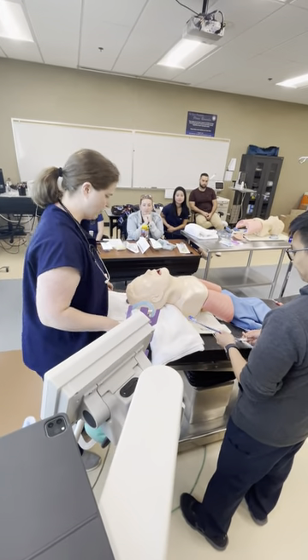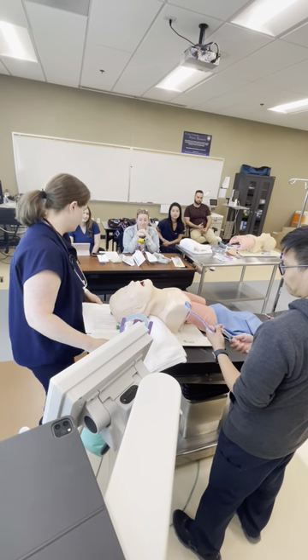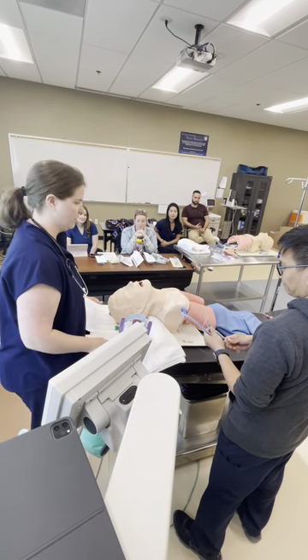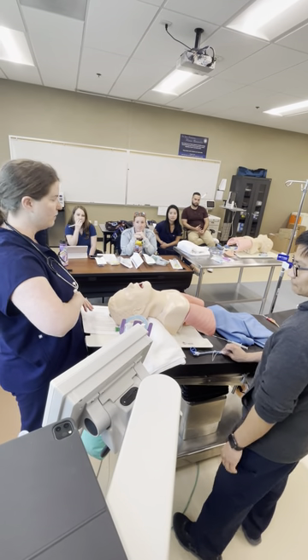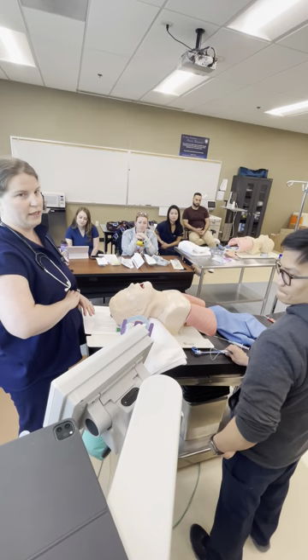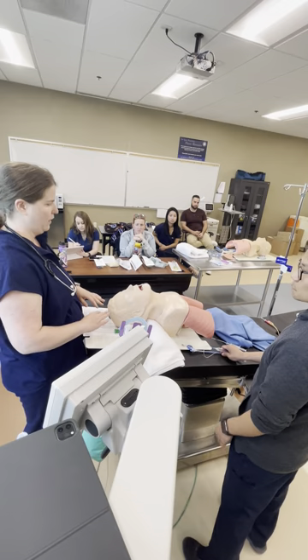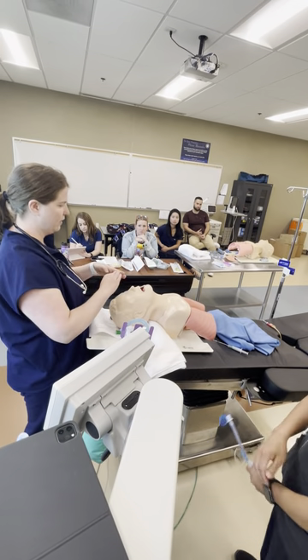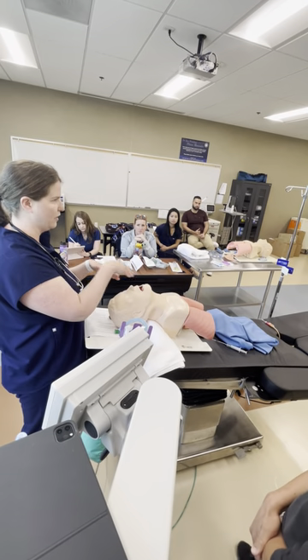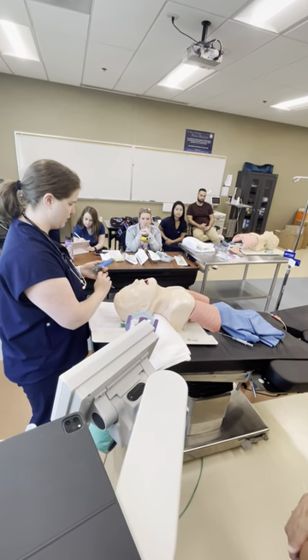Positioning is really important. For direct laryngoscopy, you want the patient's head at about your xiphoid process. For video laryngoscopy, you want them closer to your belly button. When they're at the xiphoid level, this gives you the best angle to line up all the axes and get your best view of the cords.